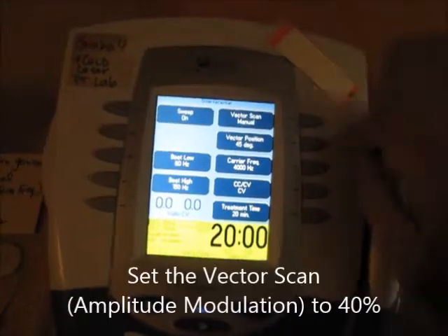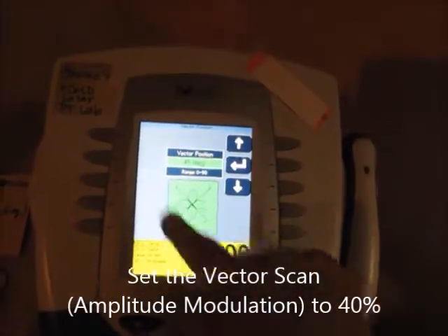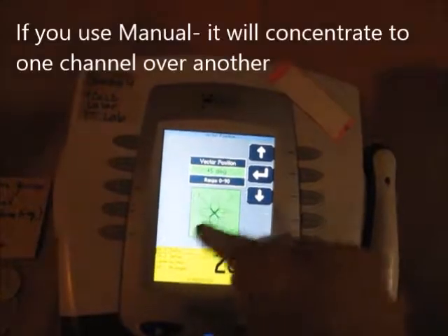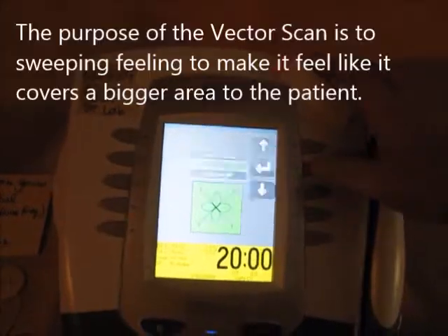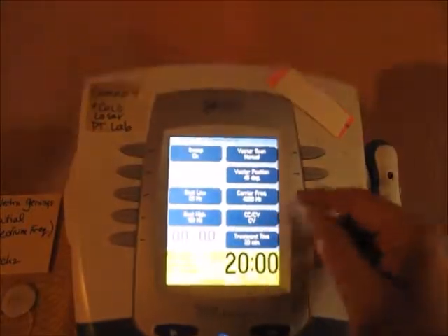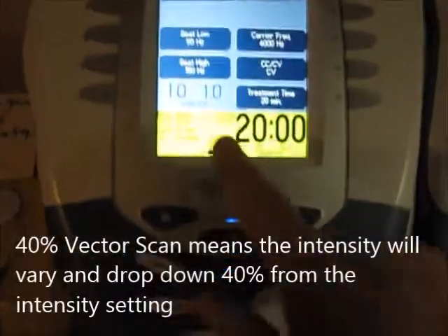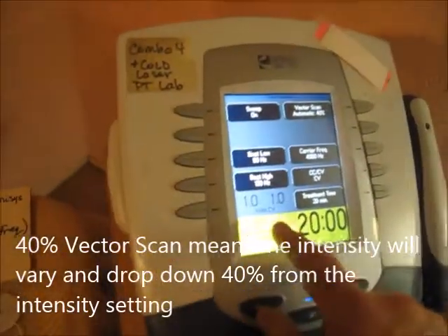You will set a vector scan, and I suggest you set it not to manual. If you look at manual, it shows this little diagram — if you have it go more to one channel, it'll have more energy to one channel. Generally, the vector scan concept is a sweeping effect like windshield wipers going across the whole treatment area. The best choice would be vector scan at 40%.